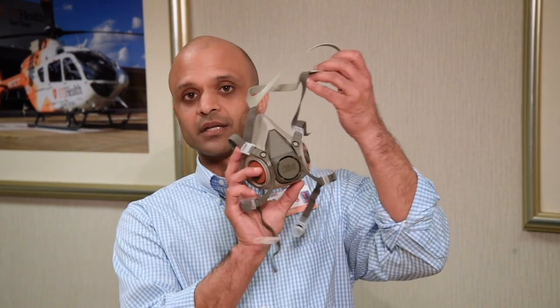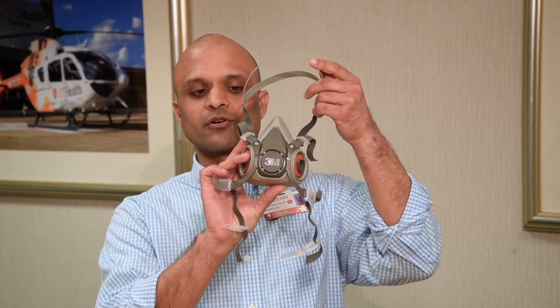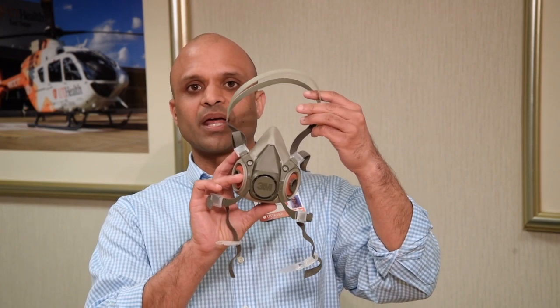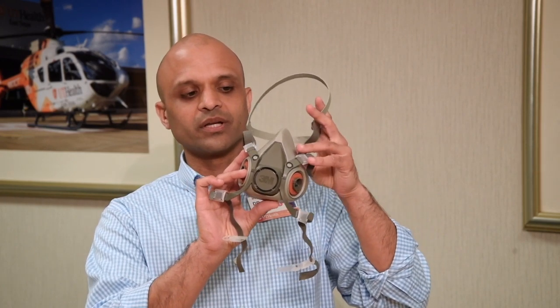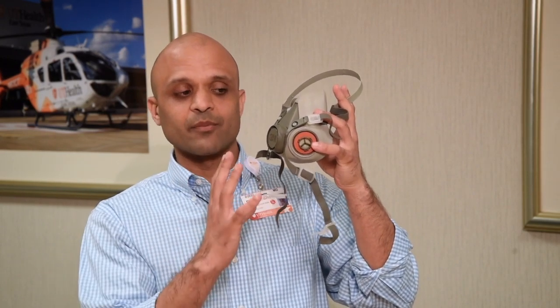Hey folks, this is Dr. Desai here. I wanted to do a quick video on donning and doffing of the 3M respirators that we have for our crew. This is during the COVID pandemic of 2019 and 2020. I just wanted to make sure everyone has a good idea on how to don and doff this thing so you don't contaminate yourself.